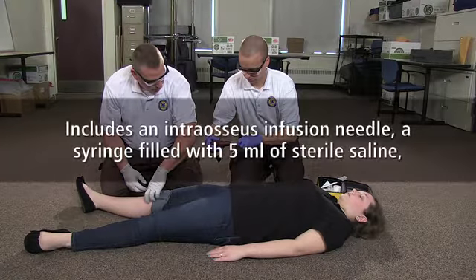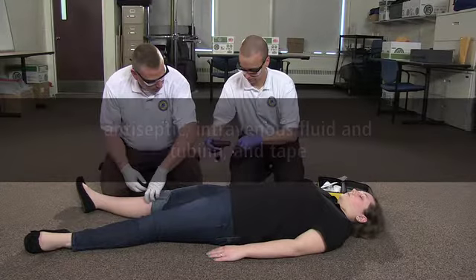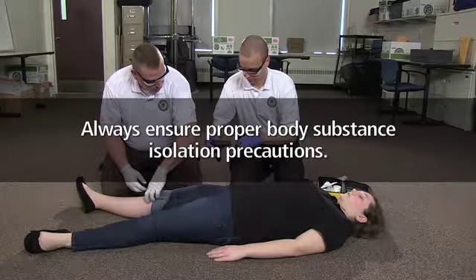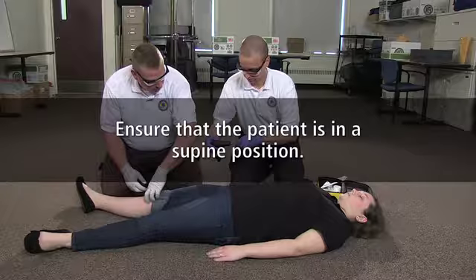To begin, the pre-hospital care provider assembles the equipment. This includes an intraosseous infusion needle, a syringe filled with at least 5 milliliters of sterile saline, antiseptic, intravenous fluid and tubing, and tape. Ensure proper body substance isolation by donning the proper level of personal protective equipment. Next, ensure that the patient is in a supine position.